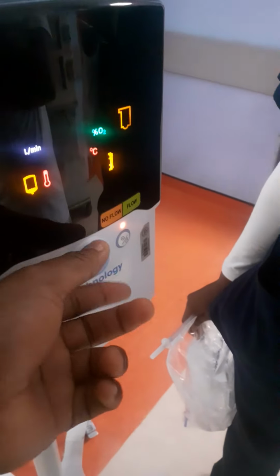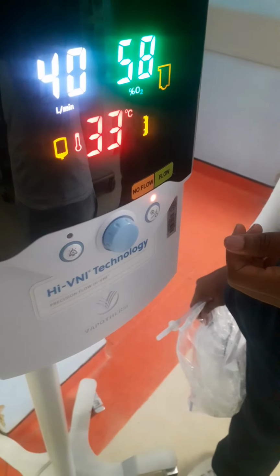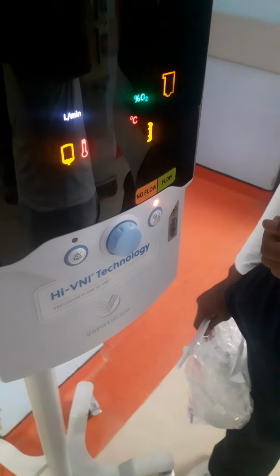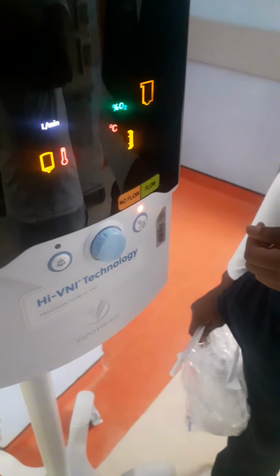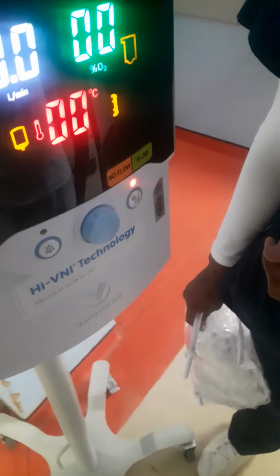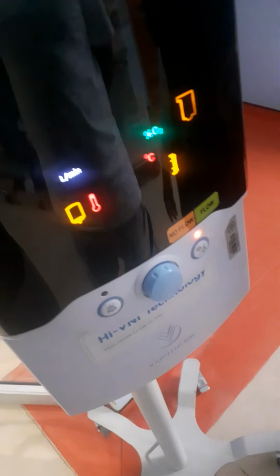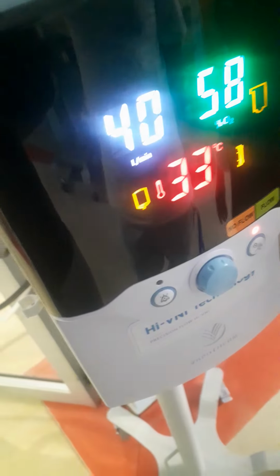Sorry, if it's lower, like 2 liters per minute, do you still need any humidifier? We don't usually go down to 2. What I know is if you are above 4 liters per minute, you must use a humidifier. So anything above 4 liters per minute, I use a humidifier. That's what I know. Which is also right, because here you start at 5, so 5 is already above 4.